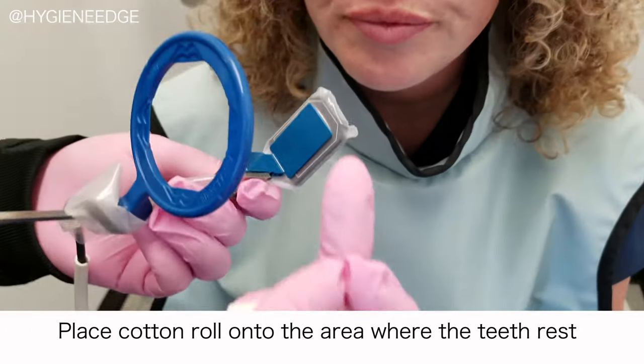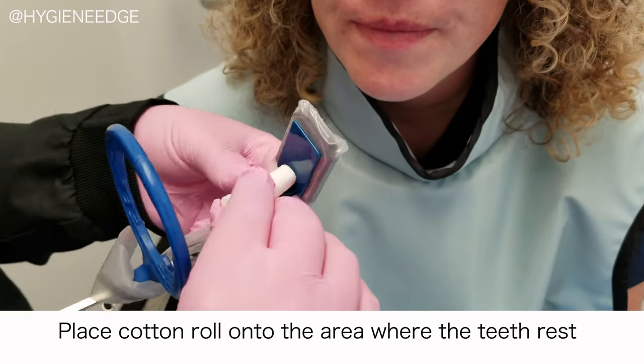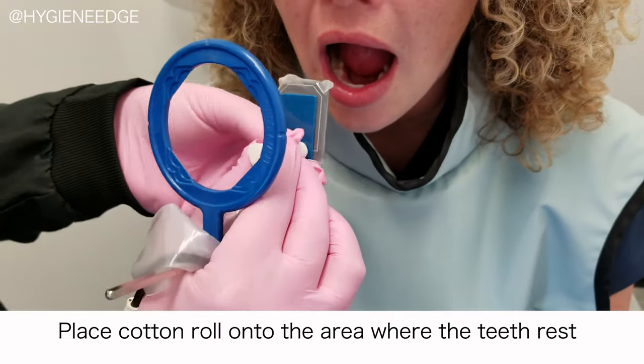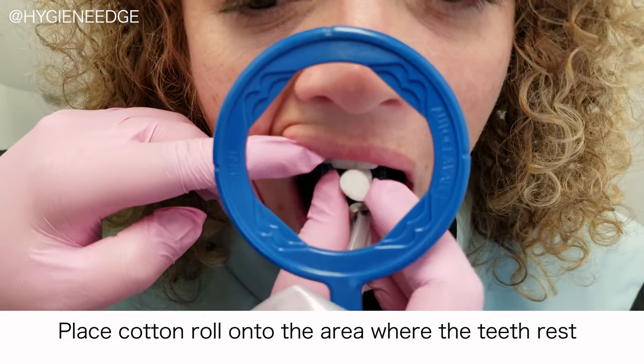Another thing I always recommend is use a cotton roll. It's a little bit of a pain at times, but this will really help prevent you from cutting off the incisal edge of the tooth. Hold the cotton roll right there — the cotton roll is going to touch the incisal edge of your target tooth.